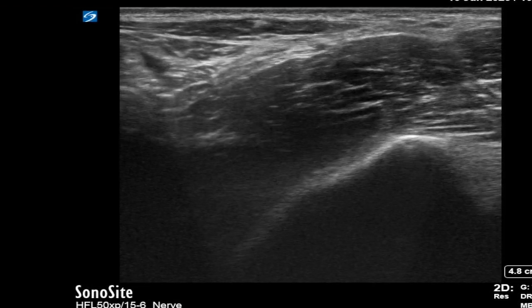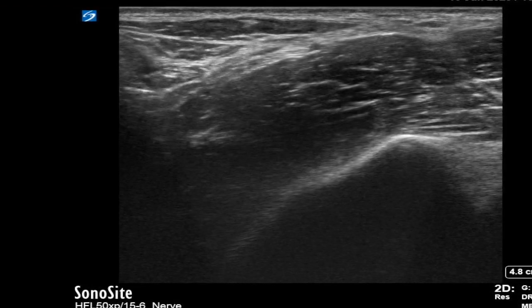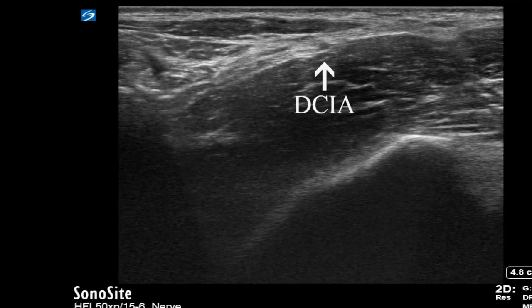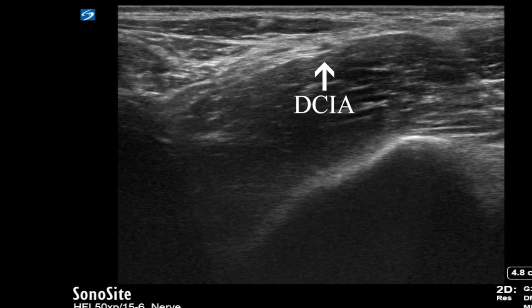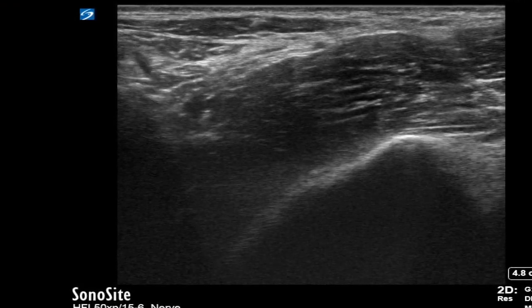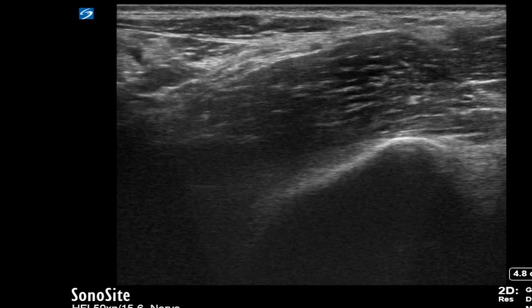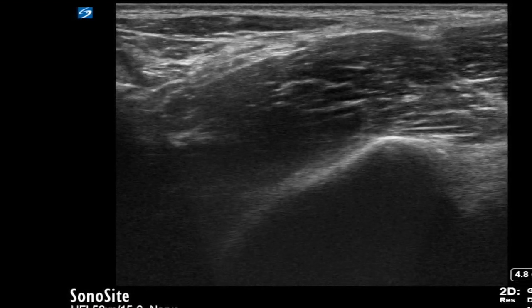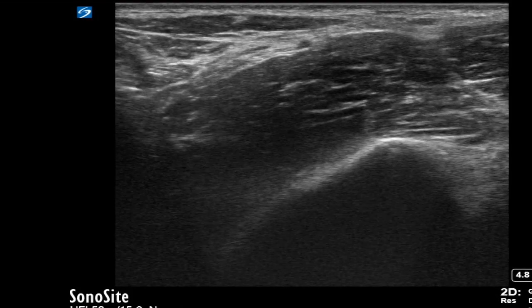Structures to be avoided when performing the block include the deep circumflex iliac artery and any visceral structures. On this image, we can see some bowel coming into view on the left hand side of the screen.